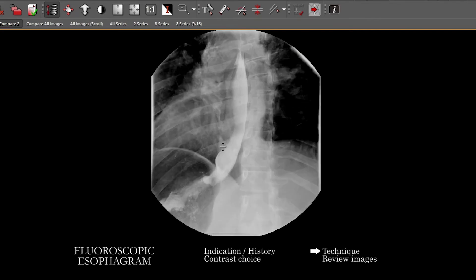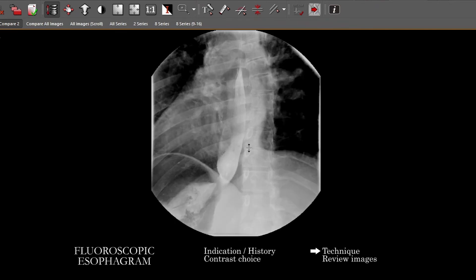When the contrast reaches the region of the gastroesophageal junction, you want the patient to perform a Valsalva maneuver so you can look for a hiatal hernia — to see if the junction goes up or if there are any Schatzki rings. Especially in the setting of reflux, you can have the patient roll over from that prone oblique position into a supine position, and then have them do provocative maneuvers to produce reflux — things like a Valsalva maneuver, leg lift, or turning to the left and right lateral decubitus positions. That will help you see reflux of contrast that's already passed into the stomach back up into the esophagus.